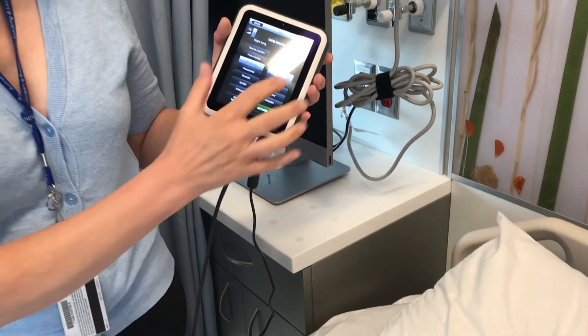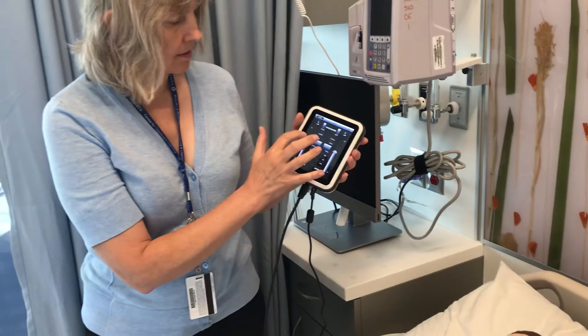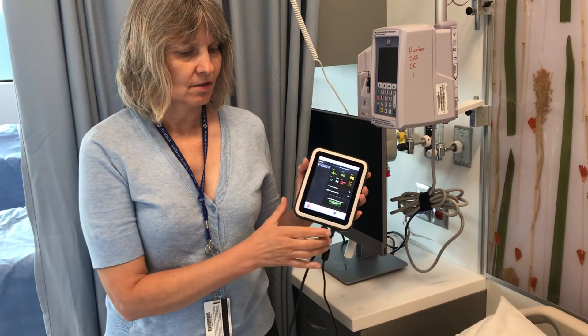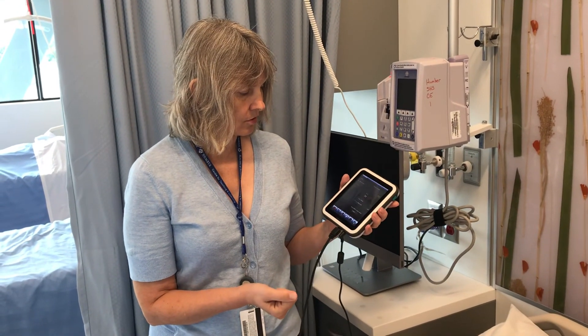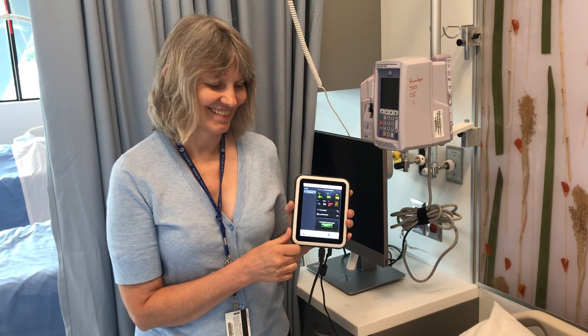When the students have heard a sound or two and can start listening more acutely, then the setting should go back to six, because that's the setting that they get tested on. So that's pretty much how to set up the mannequin, program it, and use it in class or for student teaching and student evaluating. Thank you.